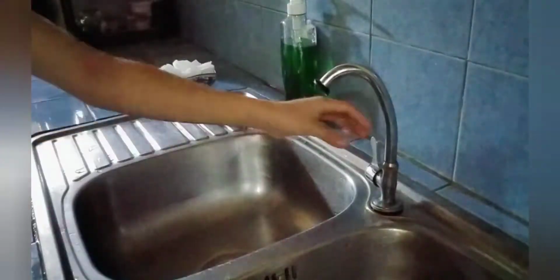And after that, perform hand hygiene. This is to prevent the spread of microorganisms.